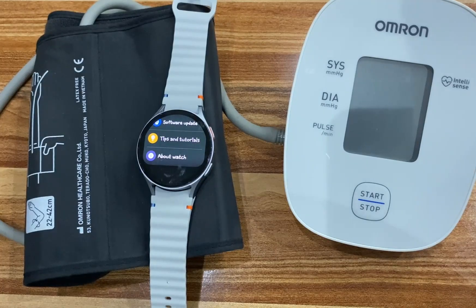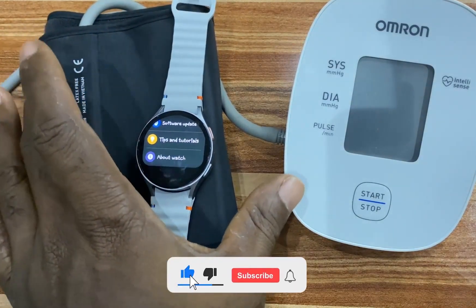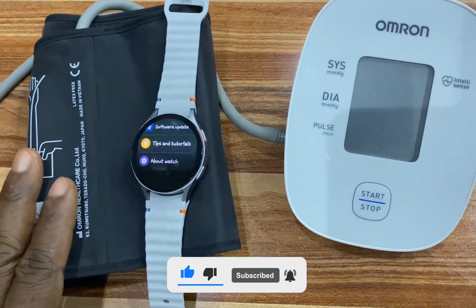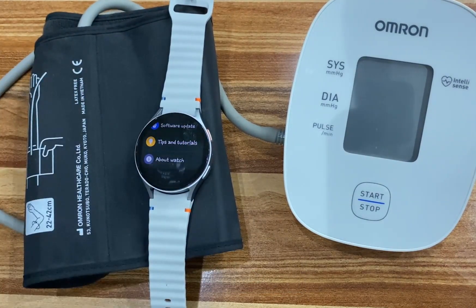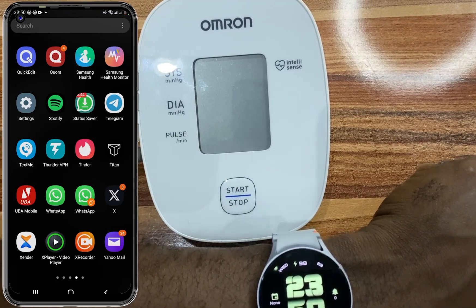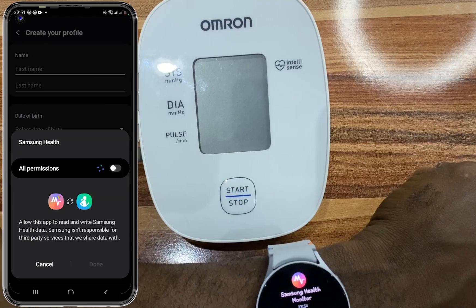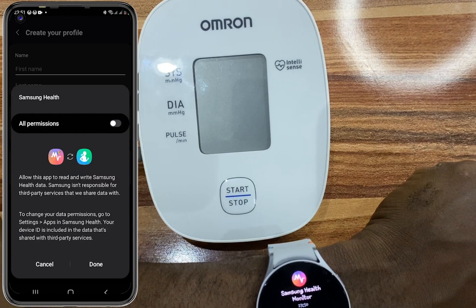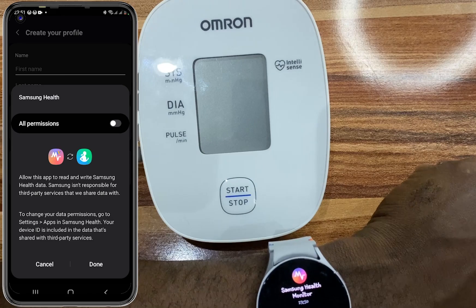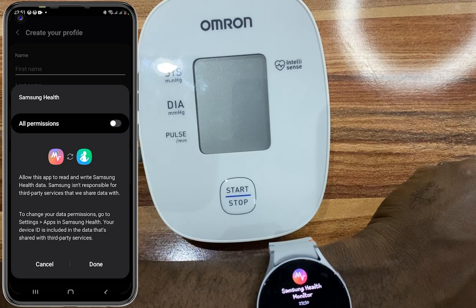With that done, the next thing we're going to do is set up blood pressure measurement on the watch. To do this, you need a cuff blood pressure monitor. I'm going to wear this on one arm and the watch on the other arm. I'll open the Samsung Health Monitor on the phone and tap on reset. If you want to sync ECG and blood pressure data from Samsung Health Monitor to Samsung Health, you need to grant all permissions. However, without granting these permissions, ECG, blood pressure, and sleep apnea will all work perfectly fine. I'll tap on cancel to proceed.